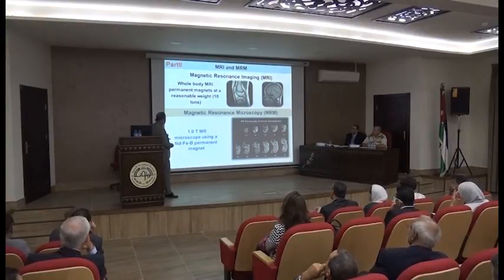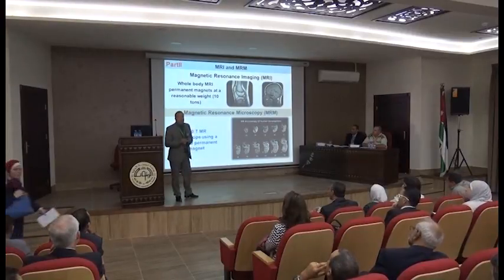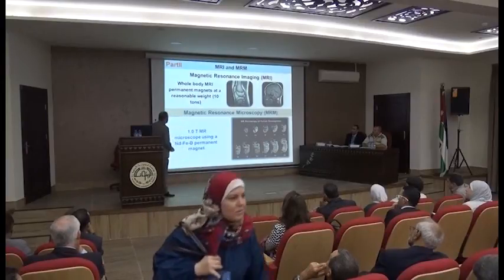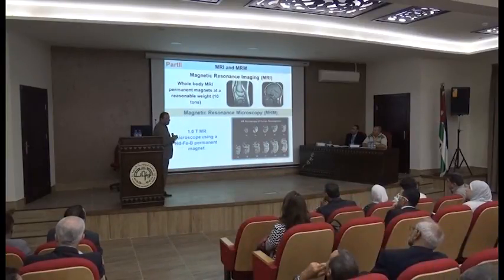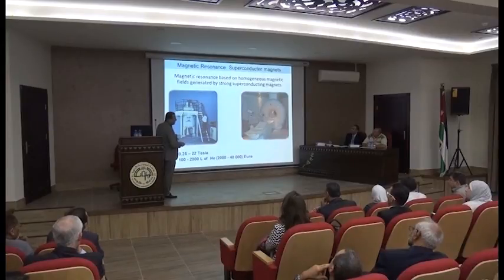In the microscope and the B1 gradient, we are able to study the spheroid, to make an image of the spheroid. And why do we need to study the image of the spheroid? I will come to this point at the end of the talk, but the development to come to this point is also done in my group. Just also important information: look, this is the MRI.